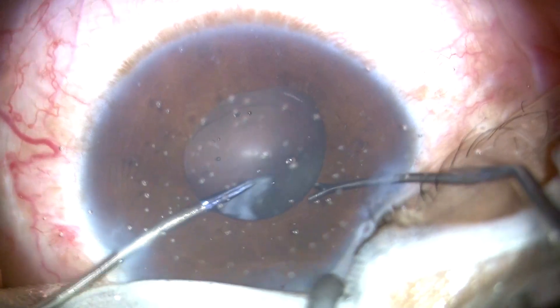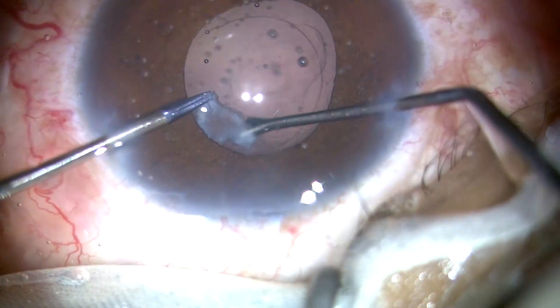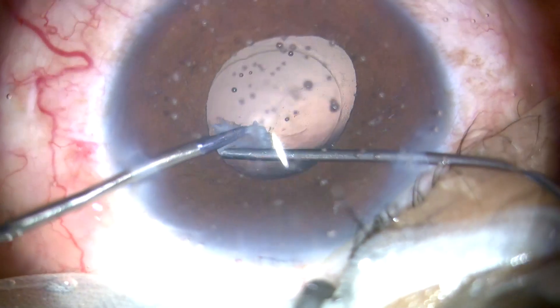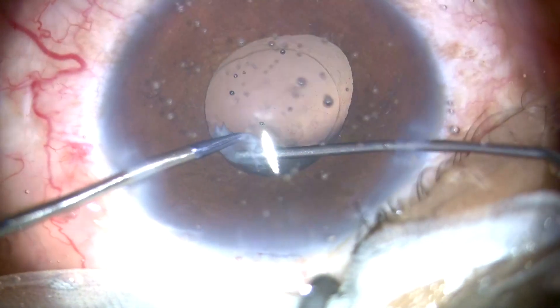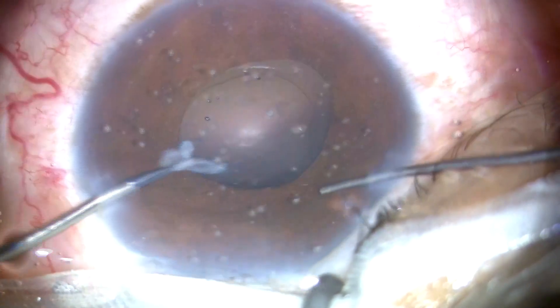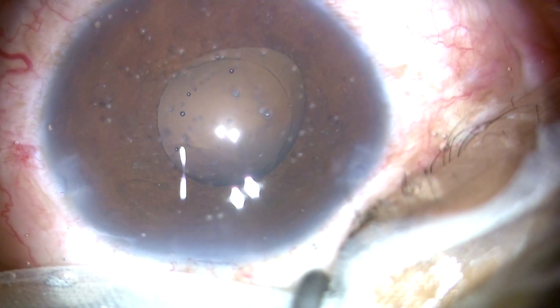Just a little bit of strip left. Now microforceps in the left hand. I am trying to shave it off the posterior capsule. And yes, I am successful. The posterior capsule is still intact. Yes, we did it.